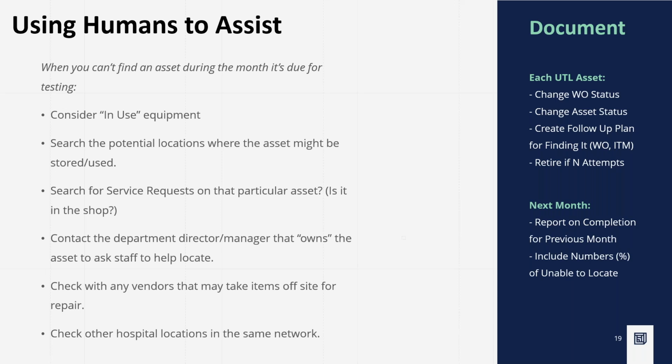Mm-hmm. Other potential application and technology there: you could link to the patient's MRN number, that's the number of the patient. You've got to be careful with patient information, so just a word of warning, if you're going to do that, be careful. Maybe that goes into your discharge system to say, hey, put the asset number in that system. Correct. Or that, rather than in your CMMS.